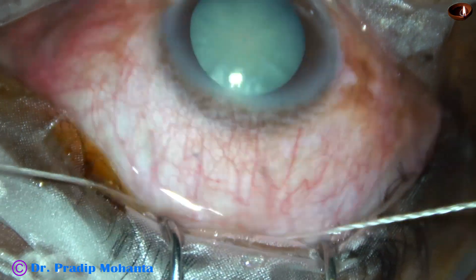What to do now? Fortunately, this is SICS, and it doesn't matter if it goes to periphery. We can safely complete the surgery. And this is the beauty of SICS.